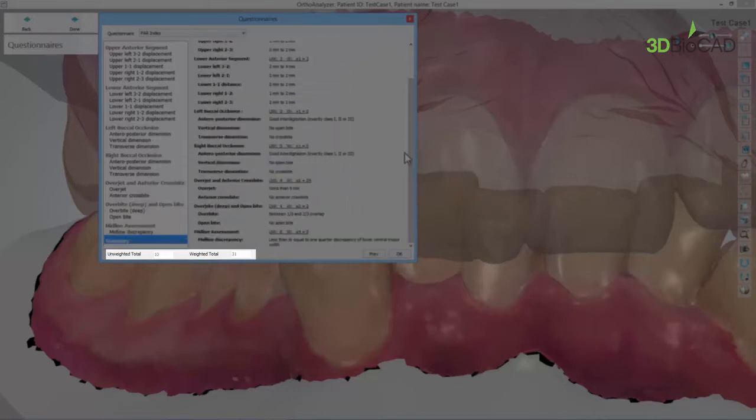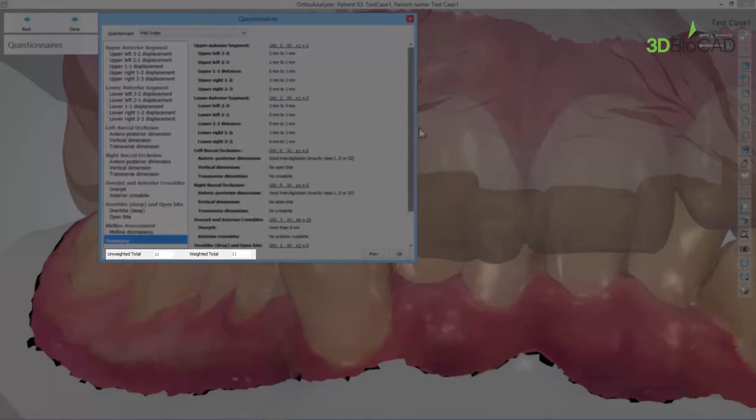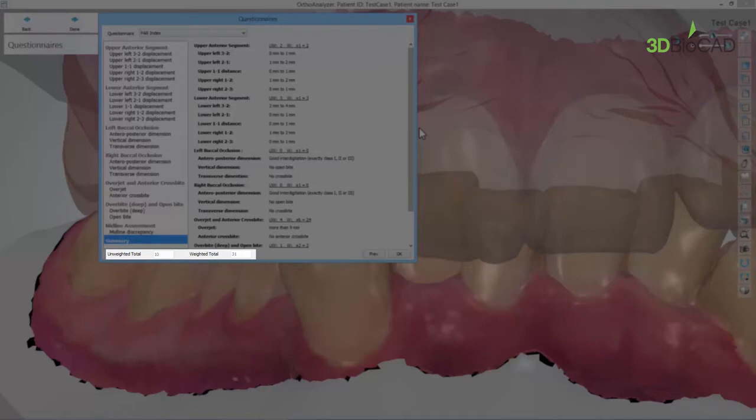The unweighted total and the weighted total boxes to the bottom of the questionnaires window indicate, if applicable, the unweighted score of all the steps multiplied by the scoring weight assigned to every one of them, respectively. Your PAR index scoring result will be the weighted total.